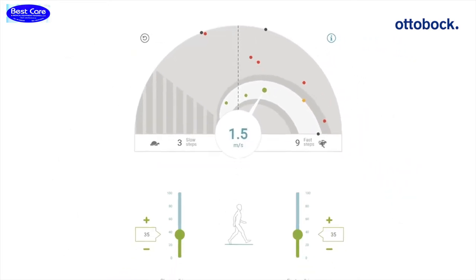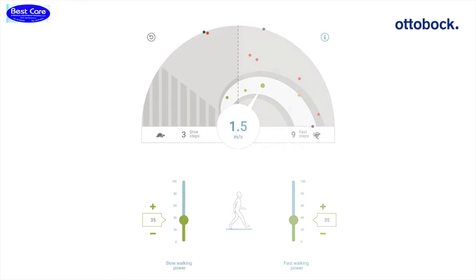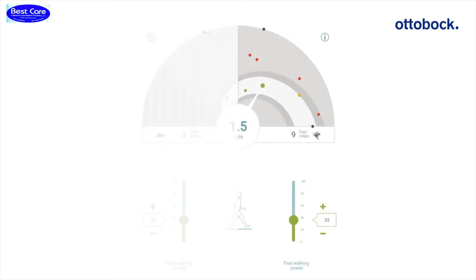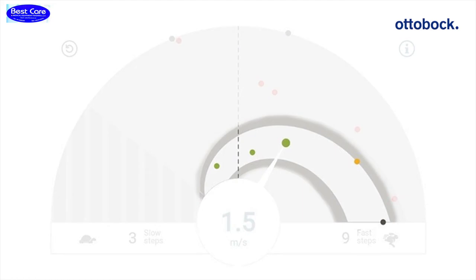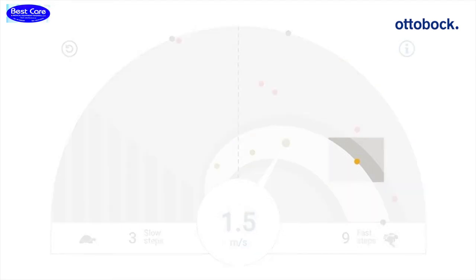If you want to adjust the plotted steps in the left area of the graphic, use the slider for slow walking. If you want to adjust the plotted steps in the right area of the graphic, use the slider for fast walking. The optimal range is shown in white. In this area the dots will appear green. Yellow dots are steps that are slightly outside of the optimal range.